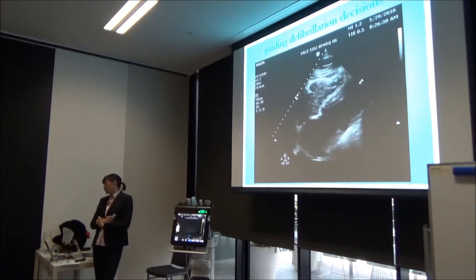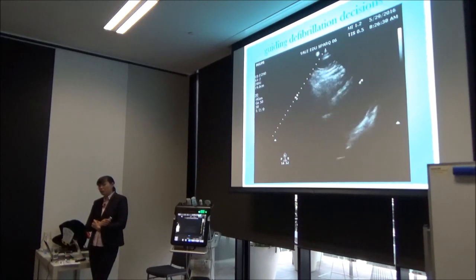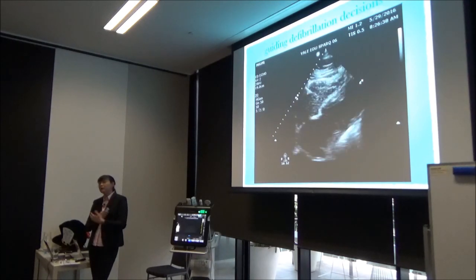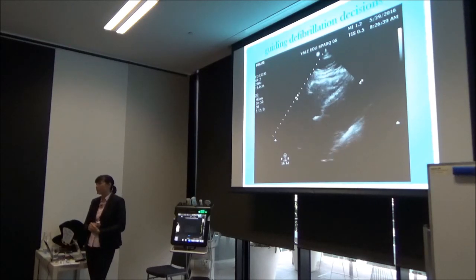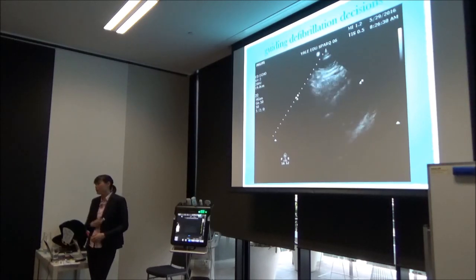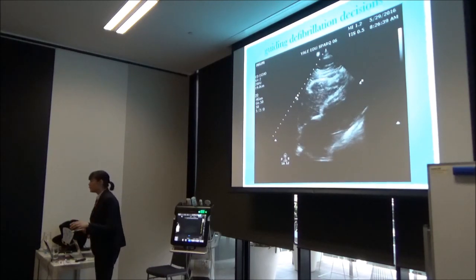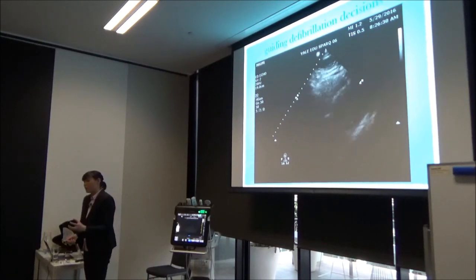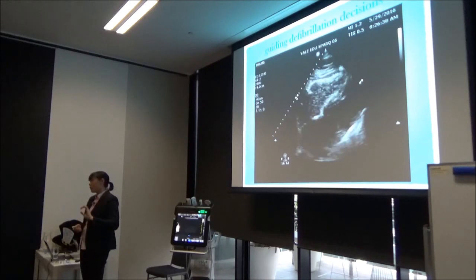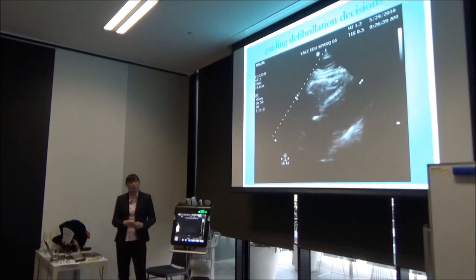What about defibrillation decisions? So there's a pile of literature that says if you have cardiac standstill, your CPR and the futility is going to increase if you see cardiac standstill. So maybe you should just give up CPR and give up ACLS. But if you look at those papers, a very small percentage of them survive to hospital discharge. Why is that happening? How can 1.6% of the study population be surviving to hospital discharge if they were dead? And we think this is the reason.